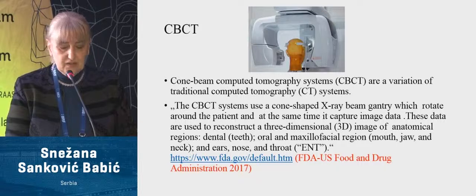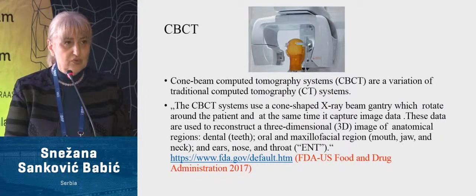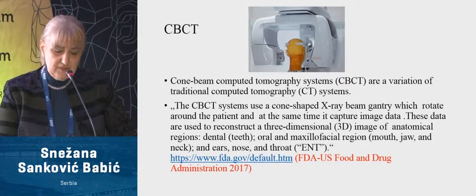CBCT, as defined and confirmed by the Food and Drug Administration in the USA, is actually a variation of traditional computed tomography systems. It has a cone-shaped X-ray beam gantry which rotates around the patient. At the same time, it captures image data.